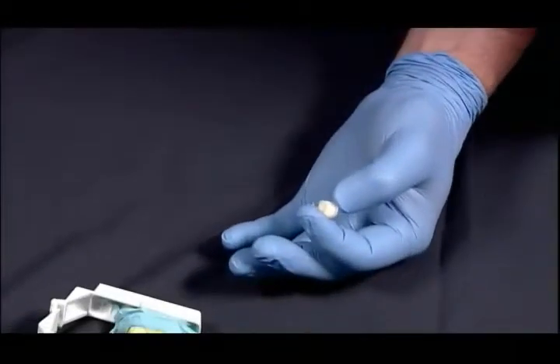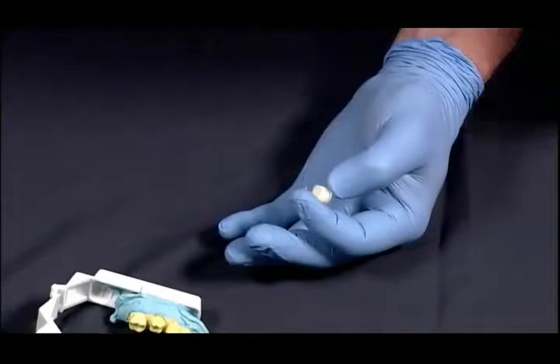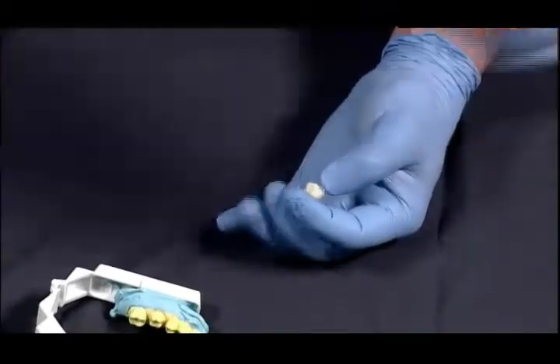I'm filling up the internal aspect of it, and once that internal aspect is filled, we'll make sure that it gets to all the edges.